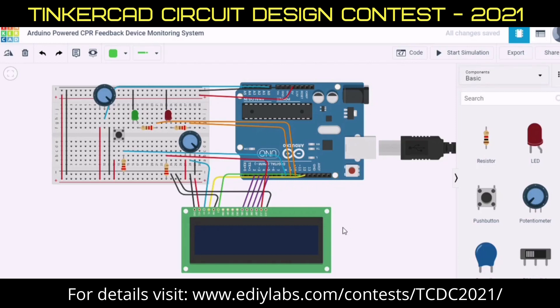Hey guys, my name is Vigneshwaran and I'm a student of Banarayman Institute of Technology. In this video we're going to see about a CPR feedback device monitoring system using the Arduino Tinkercad.